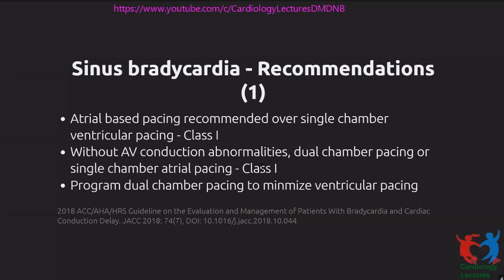The usual practice and recommendation in the West is to prefer dual chamber over single chamber. There were a lot of early trials, coming from the Danish trials, which did not really show a benefit for either of these. But there was a Danish trial which suggested a dual chamber might be better in terms of less occurrence of AF. But really, this reduced occurrence of AF was limited to a subset of patients with a PR more than 220 milliseconds at baseline.